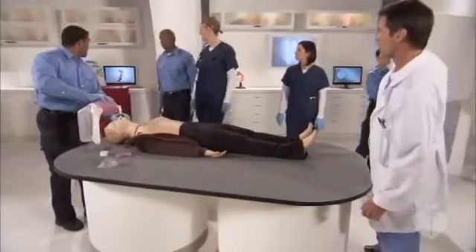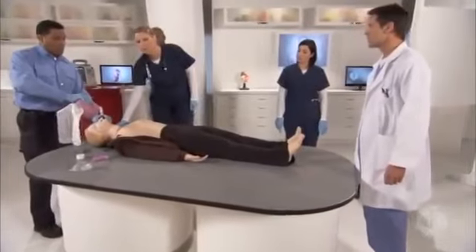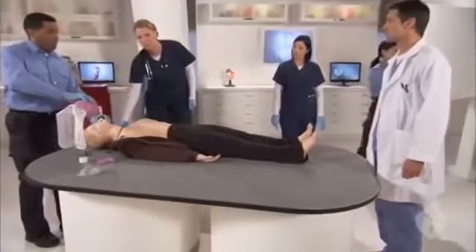Okay, we have an organized rhythm with regular complexes. Do we have a pulse? We've got a weak but palpable pulse. End-tidal CO2 is now up to 50 millimeters of mercury. Okay, great job, everyone. We're going to start post-cardiac arrest care. I'll need a blood pressure, a set of labs, pulse ox, and let's get a 12-lead ECG.